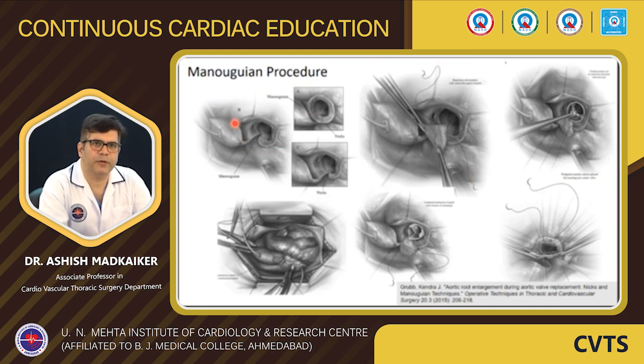This is an oblique aortotomy, and then it has extended into the commissure between the NCC and LCC and onto the mitral valve. If we had to do Nicks, our incision would have extended in this line, causing this defect. The same defect is filled with a pericardium or a Dacron patch. So its suturing starts from the edges, cut edges of the mitral leaflet and extends onto the annulus and then onto the aortic wall. Now this becomes the new annulus, and we size the new annulus. After sizing the new annulus, we are able to oversize the valve by at least two sizes.